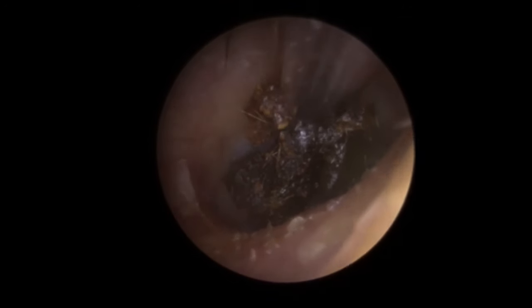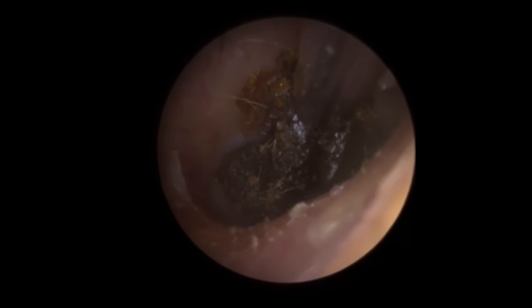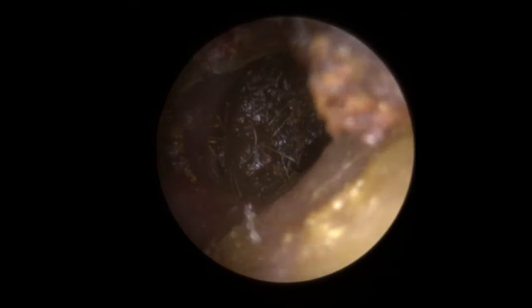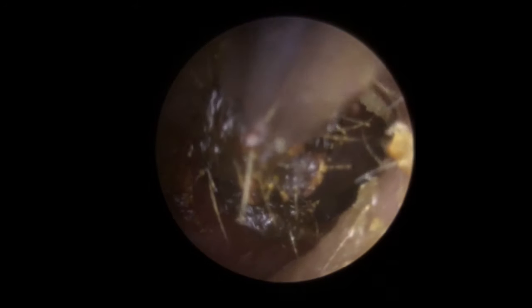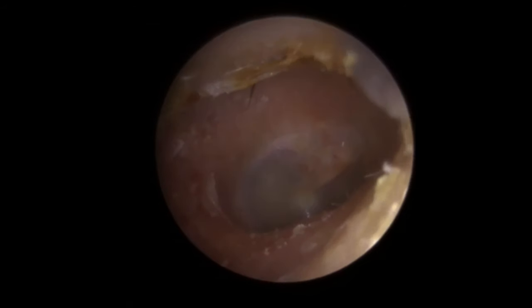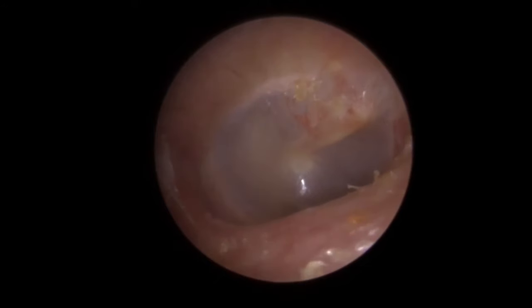I'm just not pressing onto it — just trying to stay slightly away from it and drawing it towards us. There we go — you can just see we get that little bit of movement. The top section has broken away, but it's actually brought that wax further down the canal. You can see as it got sucked towards the end of the tube there. Very, very dark, almost black in colour — a very old wax. There we go — we can see the eardrum there, all looking nice and healthy. Patient hearing a lot, lot better.